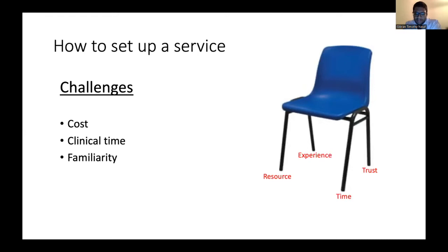Ultimately, and particularly in radiology, you require the referrals from other clinicians. You require the trust to do these procedures. And then you build the experience. Once you have that, you have a stable footing. And these challenges, to me, translate into the following: cost, clinical time, and familiarity. And I'll try to address each one in turn.